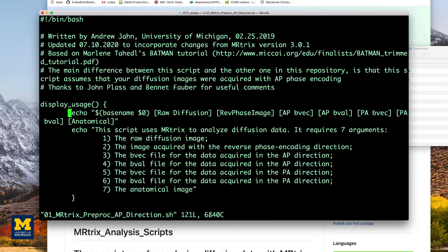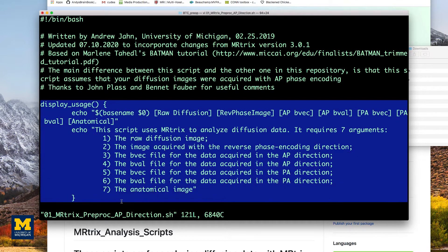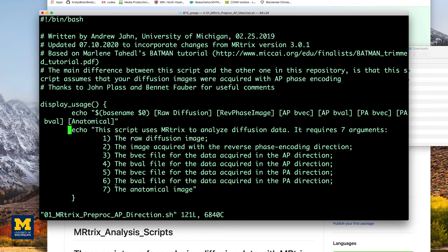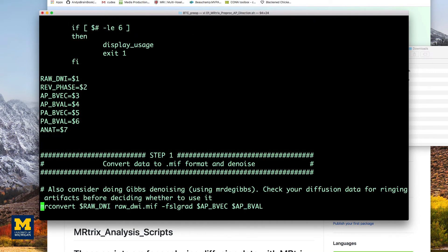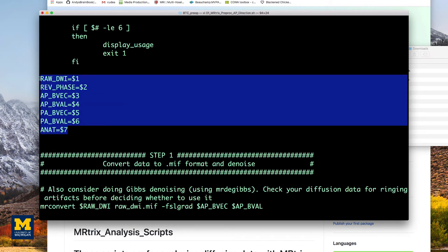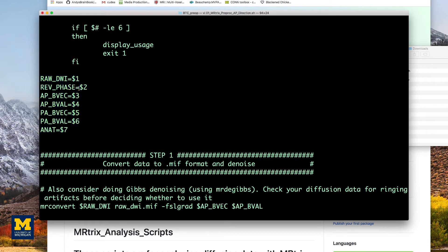This is the help text that tells you what images to input in what order to use the script. The last fields here, marked by the numbers one through seven, preceded by a dollar sign, are the arguments that are passed to the script. You will need to input the arguments in the exact order that is listed.